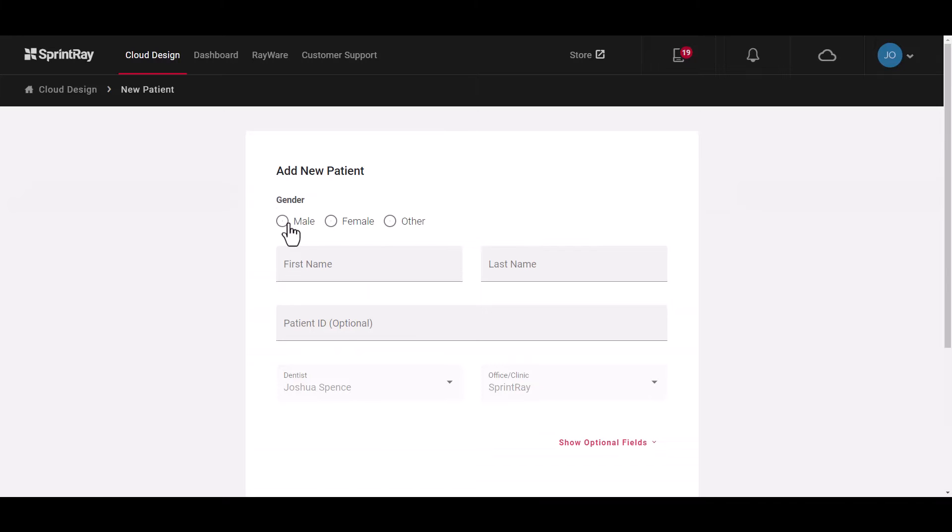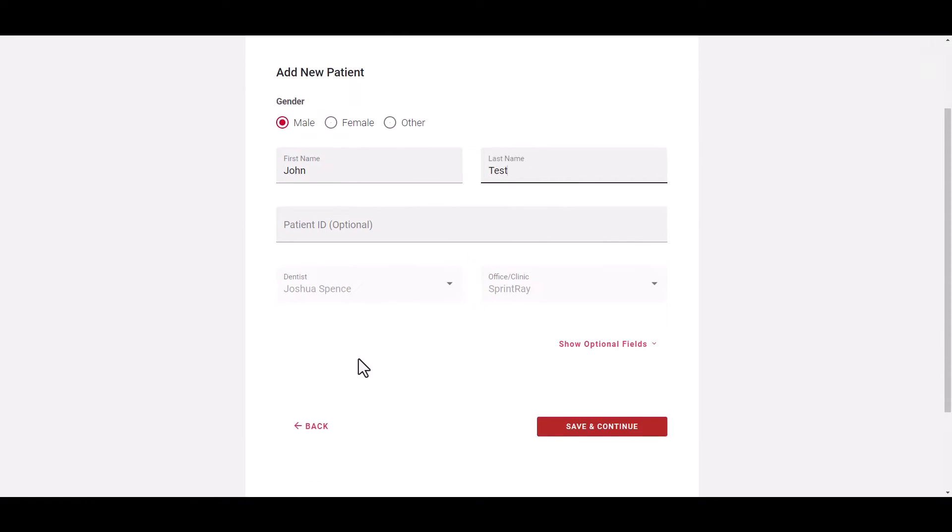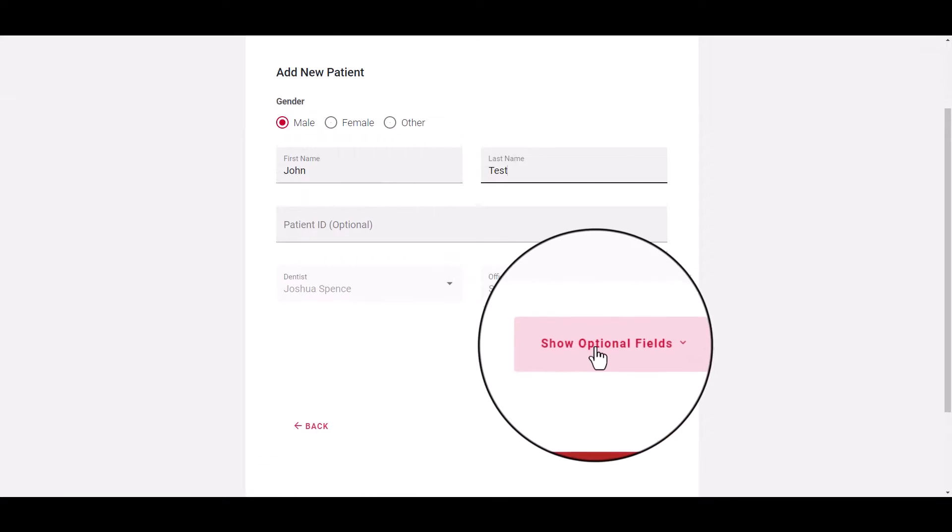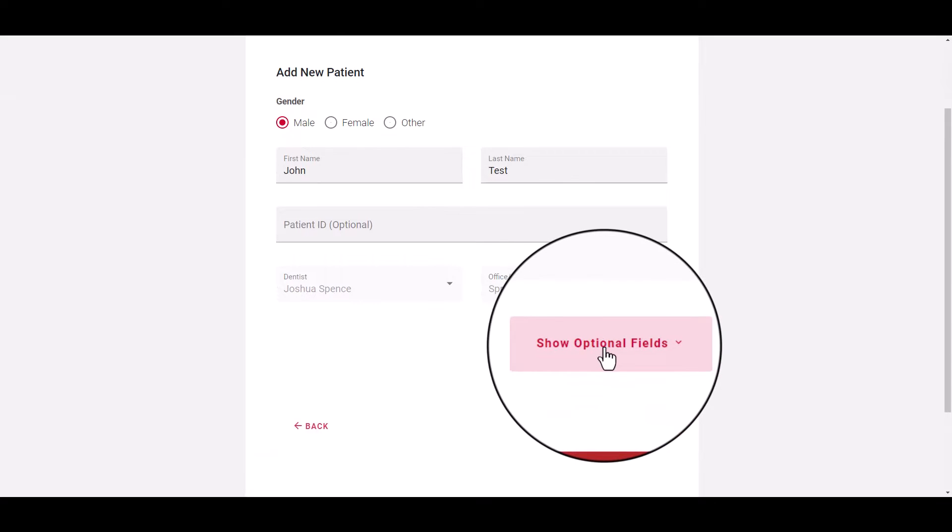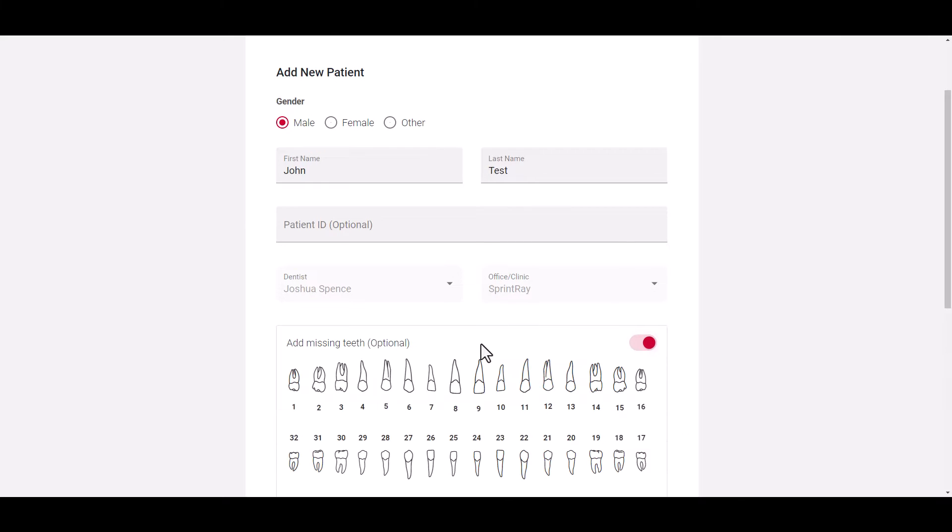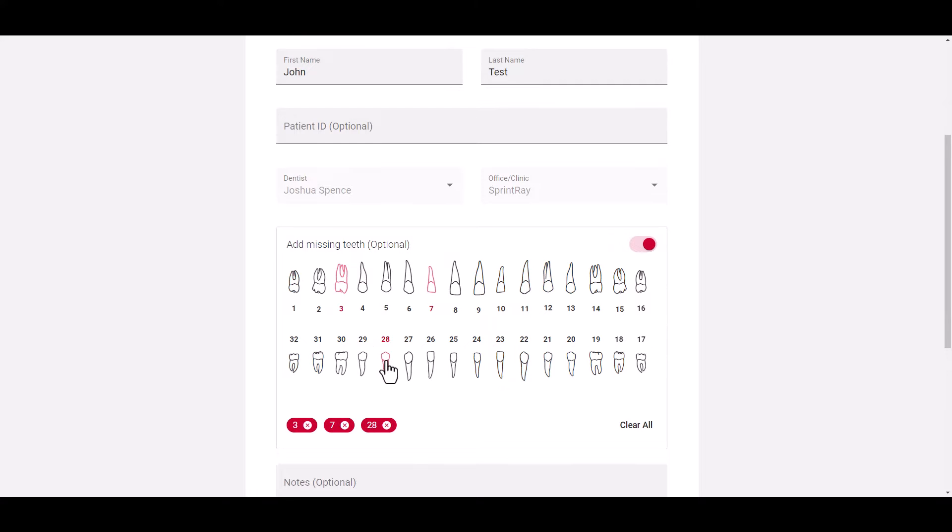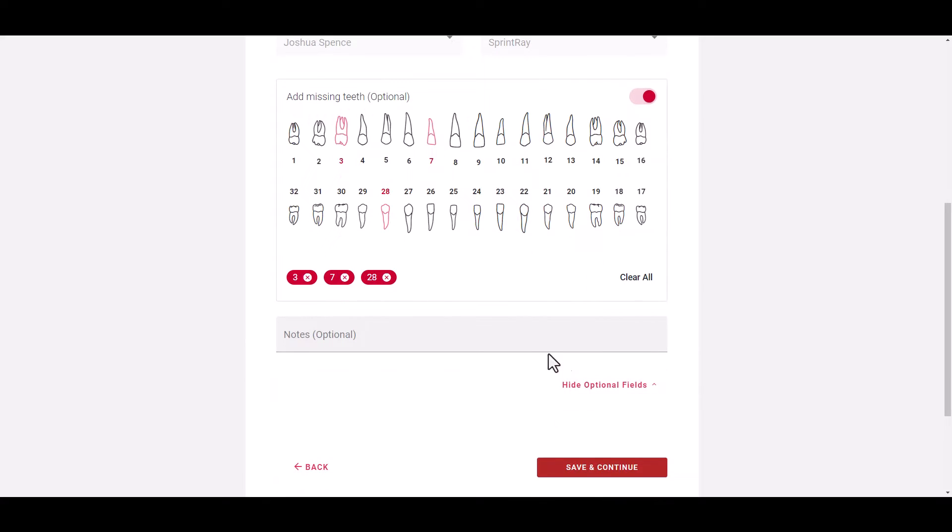You can create a new patient by clicking the new patient button at the top right and input the patient details. New options on the patient page allow you to open the optional fields and specify certain things like missing teeth or add patient specific notes which can be referenced at any time during a treatment submission.